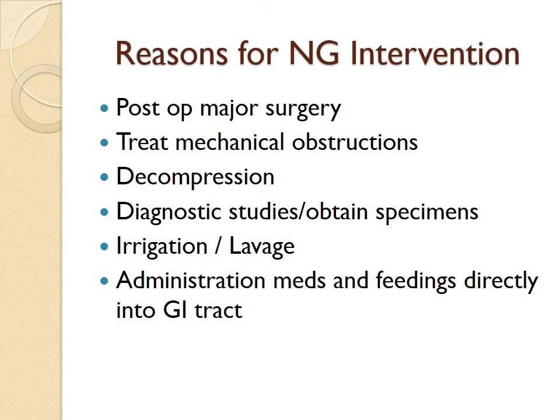For feeding or for medications, something has occurred above the stomach area, and we do not want anything to aspirate into the lung cavity. So we will be able to place the tube to give them nutrition while things are determined about what's going to go on. And this is usually a temporary bypass area.